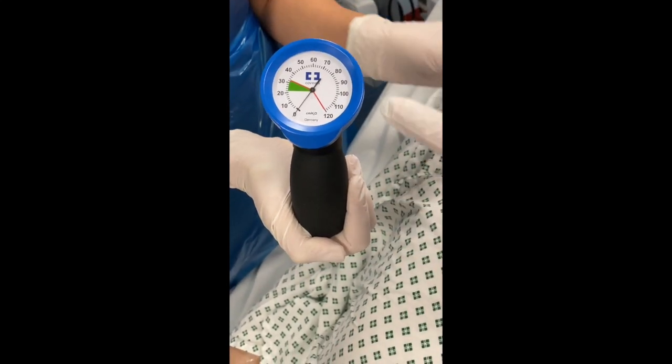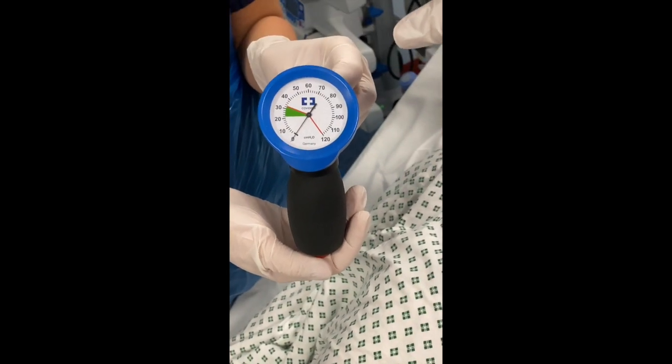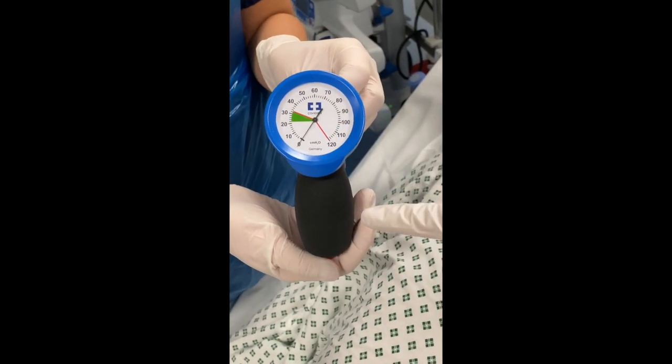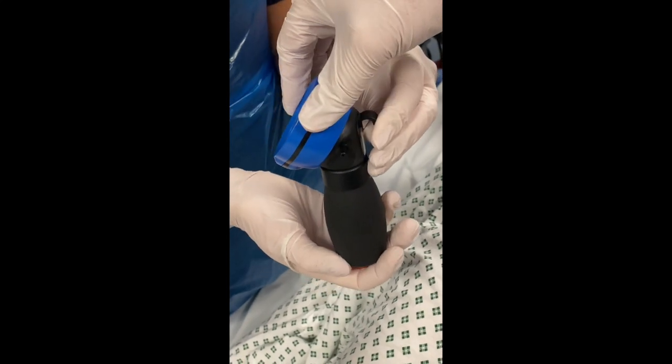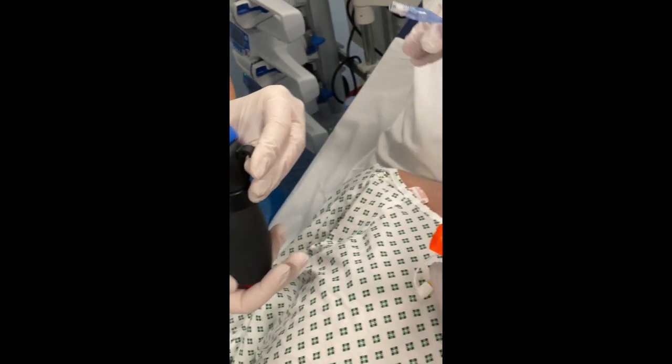The cuff pressure manometer is one single piece, so nothing gets dismantled. As you can see, it is a manometer similar to the blood pressure one, but on the side it has got one single opening that will be connected to the ET tube cuff.